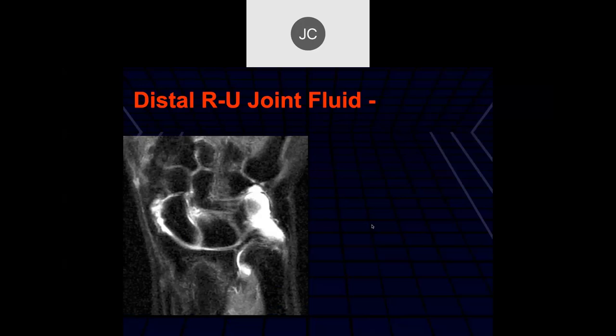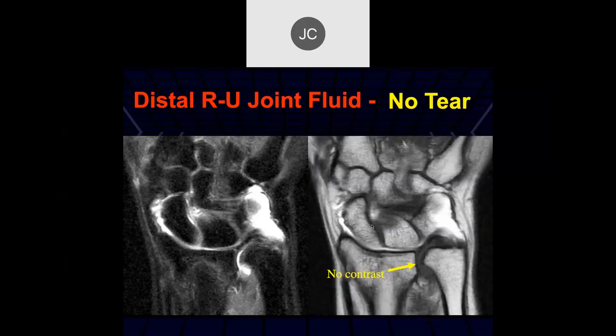Robert, what do you think of this case? Here it does look like there's a little bit of fluid in the DRUJ, but I don't see a definite tear. Now, this is an arthrogram — here's what the T1 weighted image looked like. So it doesn't look like there's contrast there, so I don't think there's a tear.